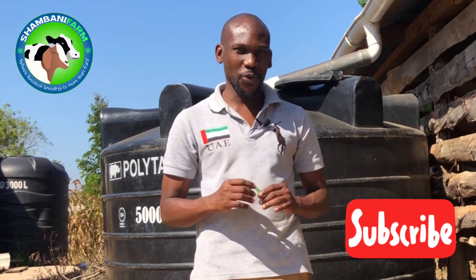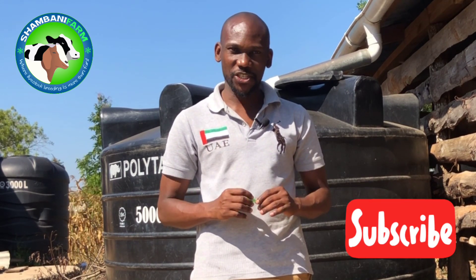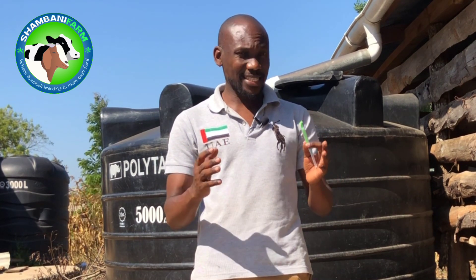Hello and welcome to Shambani Farm. In this quick video I want to show you how to properly administer a subcutaneous injection — some call it in short a sub-Q.